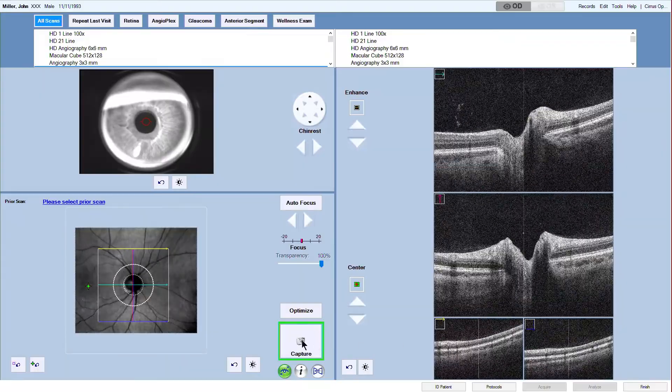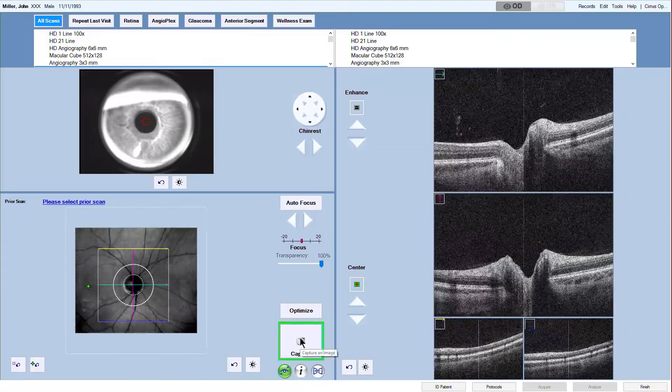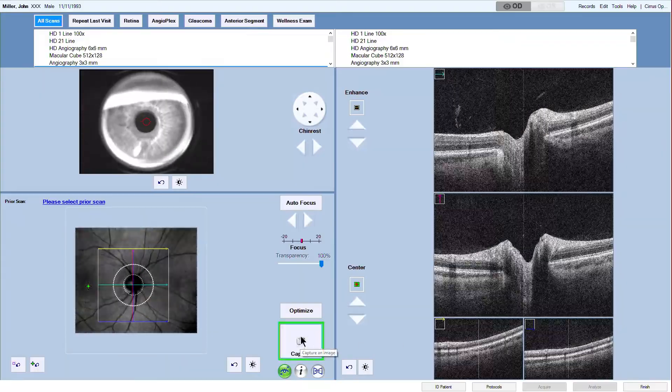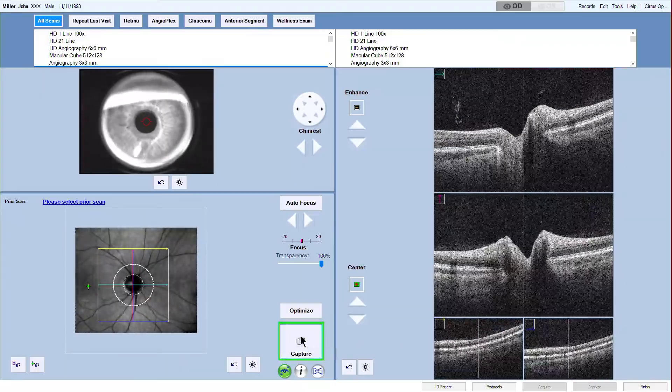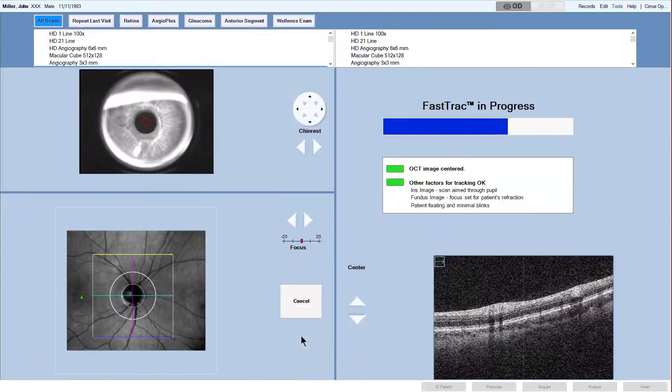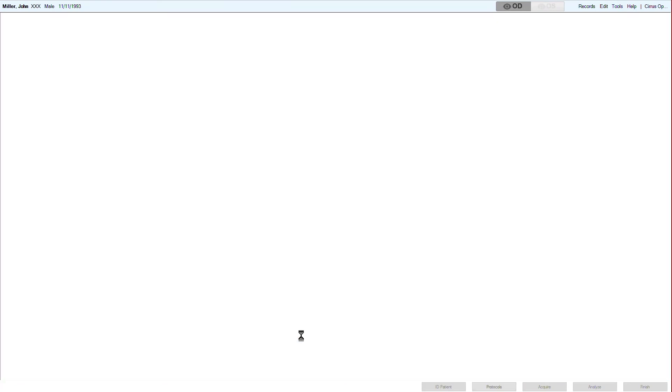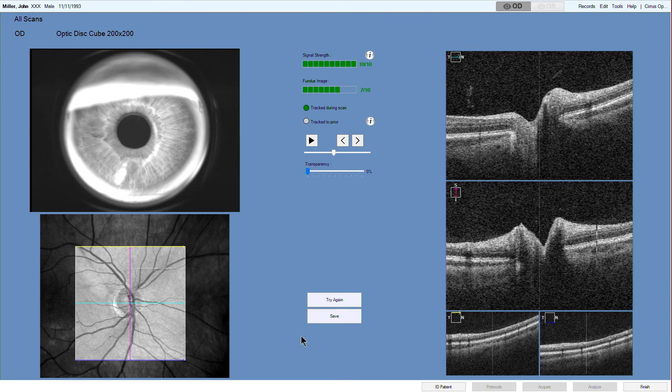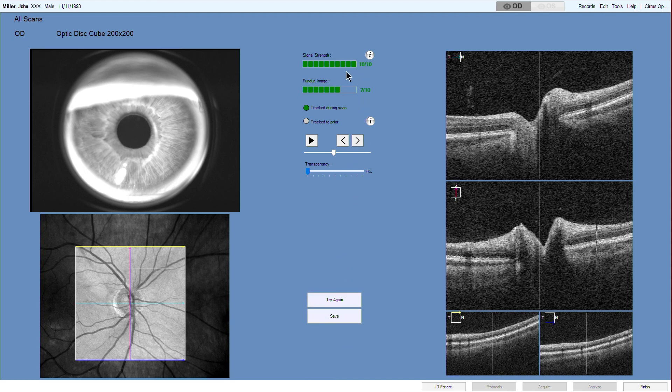After you are satisfied with all previous steps, let the patient blink once again and click capture. During fast track acquisition, after clicking capture, a screen appears that shows the scan in progress and provides controls to adjust and help to complete the scan.